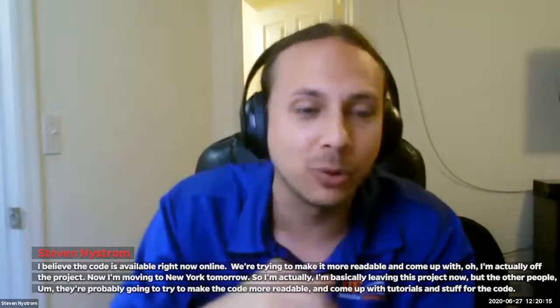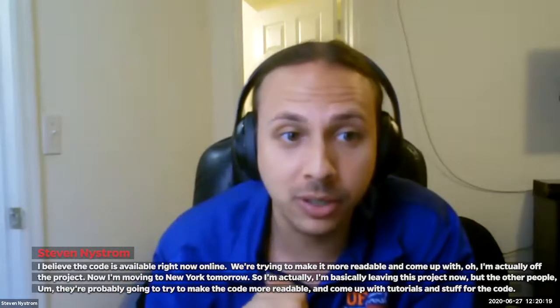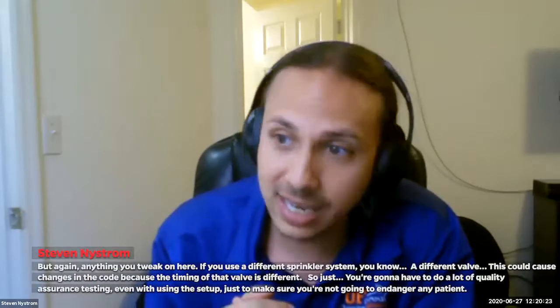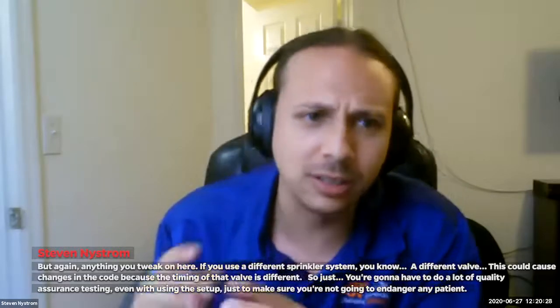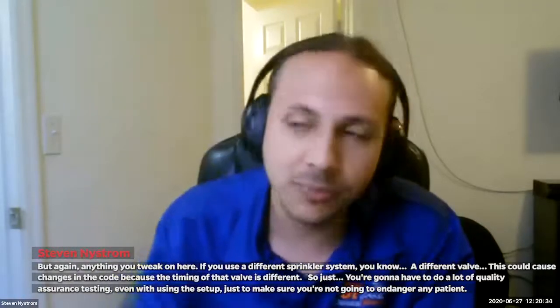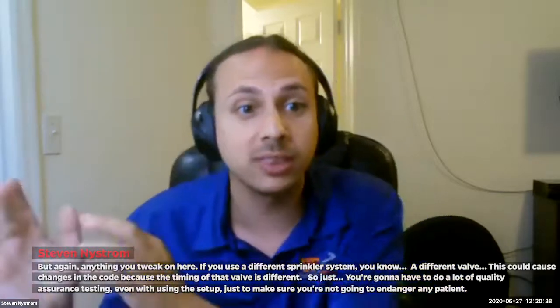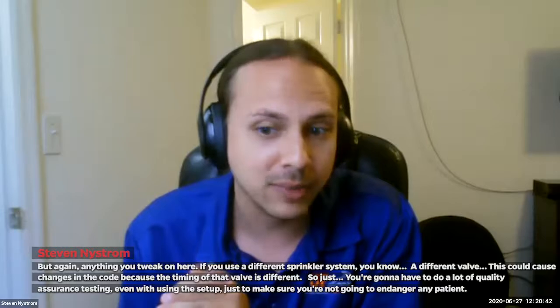But the other people are probably going to try to make the code more readable and come up with tutorials and stuff for the code. But again, anything you tweak on here, if you use a different sprinkler system or a different valve, this could cause changes in the code because the timing of that valve is different. So you're going to have to do a lot of quality assurance testing, even with using this setup, just to make sure you're not going to endanger any patient.